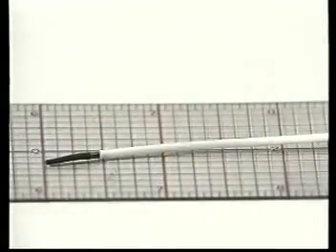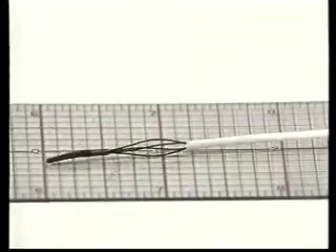The PTD should be deployed by retracting the catheter over the basket, not by pushing the basket forward. This is similar to deploying an IVC filter. Gripping the catheter of the device too tightly during deployment will cause the basket to move forward rather than the catheter retracting to expose the basket.